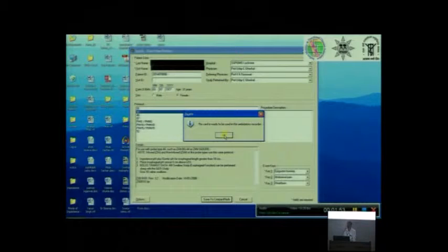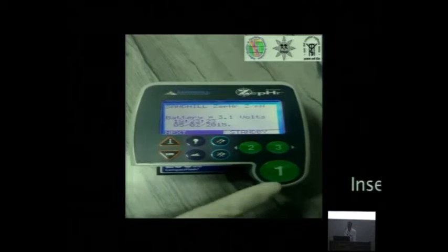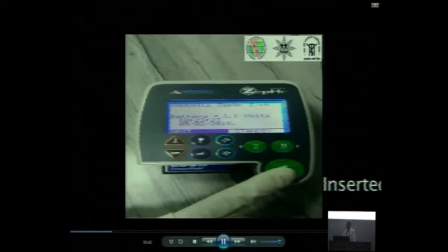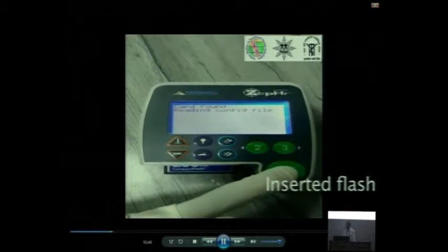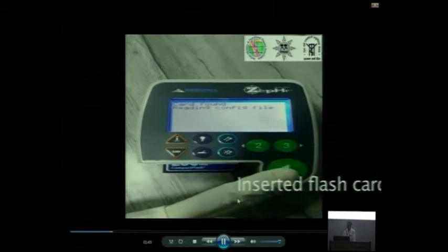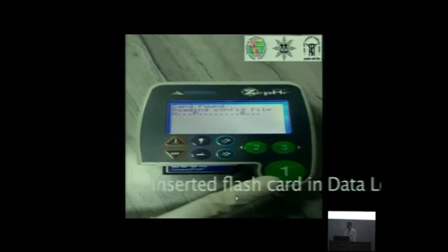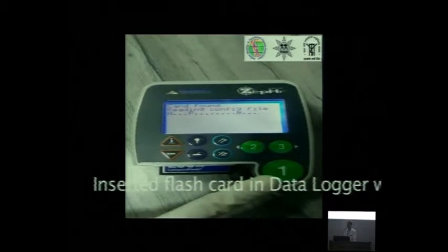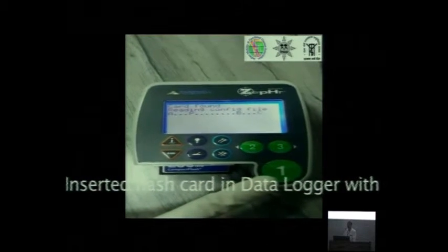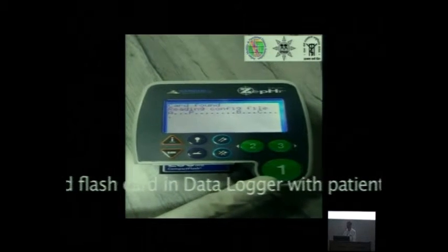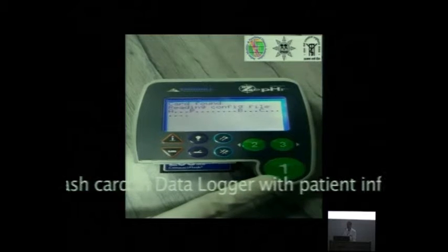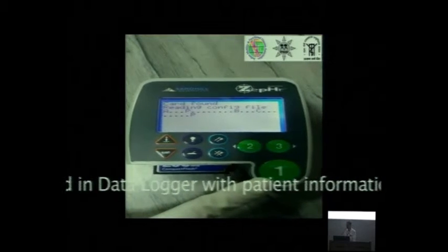Key three is heartburn. The compact flash is this one. Look at this, this is the compact flash. Now you insert the flash, and one is the enter key. When you press one, it will detect the compact flash. It says card found, reading the configuration file.